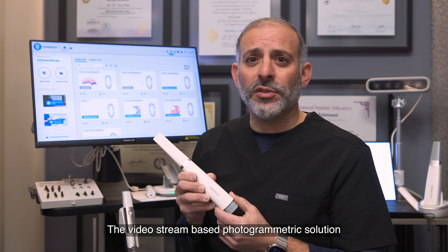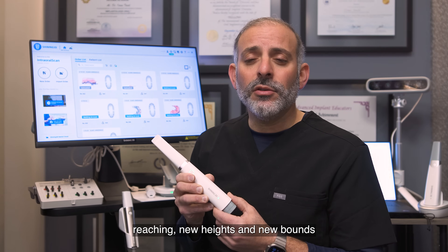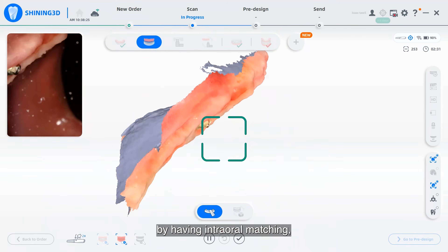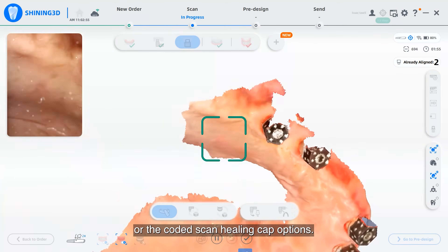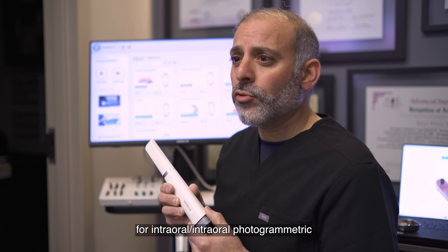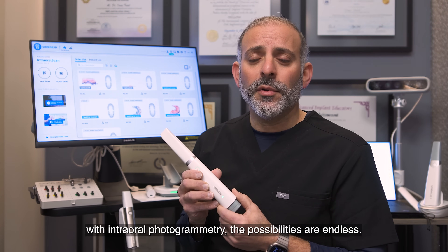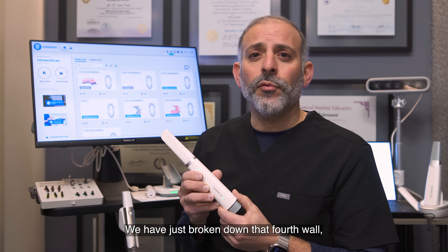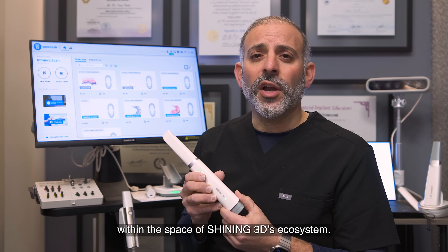The video stream-based photogrammetric solution is the next step in the evolution of photogrammetry, reaching new heights and new bounds that no other photogrammetric system can be compared to. By having intraoral matching utilizing the tissue scan feature options or the coded scan healing cap options, we have now entered the next dimension of the 4D solution for intraoral photogrammetric scanning combinations. We have just broken down that fourth wall, and we will continue to do so by innovating and progressing within the space of Shining3D's ecosystem.